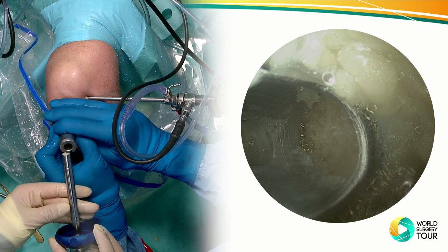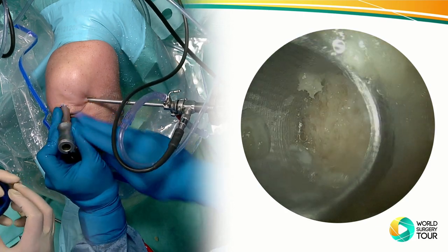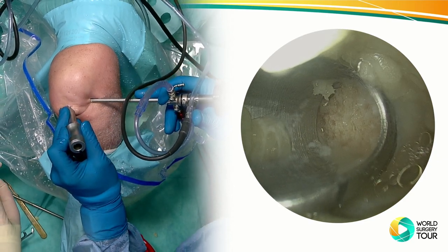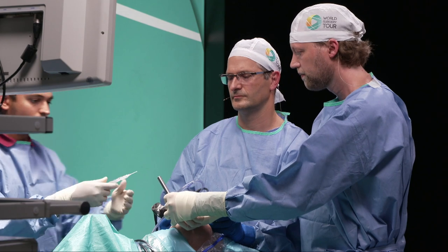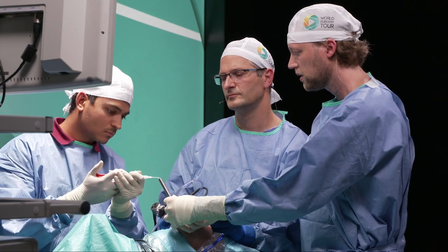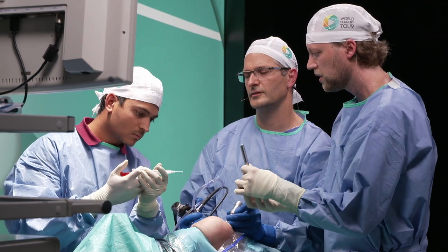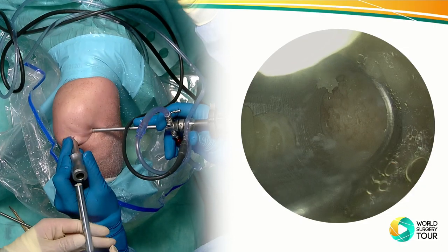New fibrin, please. Yeah, please give me the fibrin glue. Hold it. Okay, a little bit on top, just a little bit. Do you have a new cannula? Yeah, okay. Here we go. Wait. Okay, hold on. Not too much.